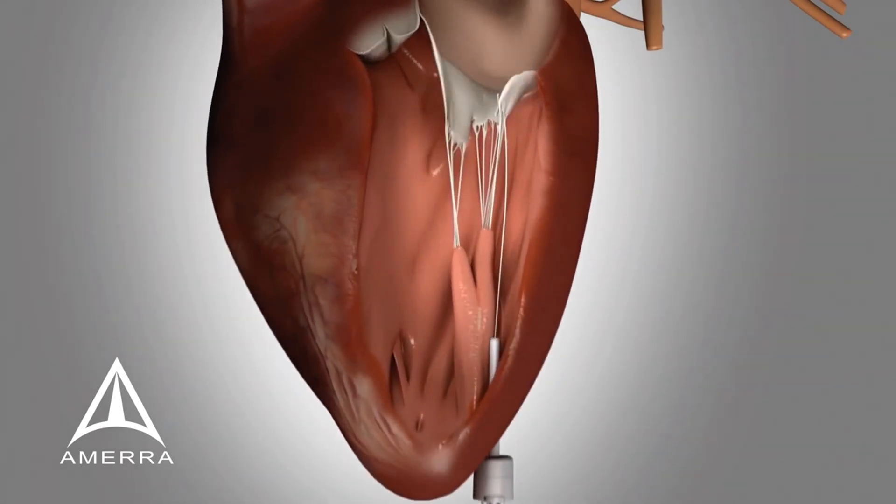The device is then removed from the body, leaving only an EPTFE suture secured to the mitral leaflet with a bulky knot and passing out of the heart through the introducer. If necessary, this procedure can be repeated multiple times via the same introducer valve.